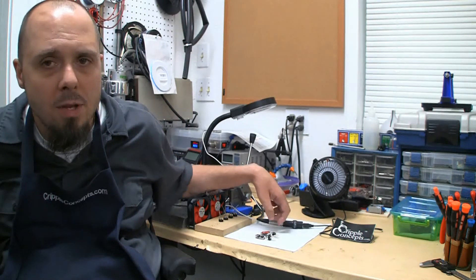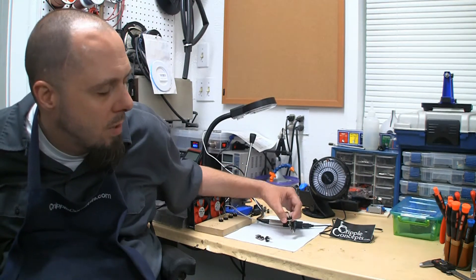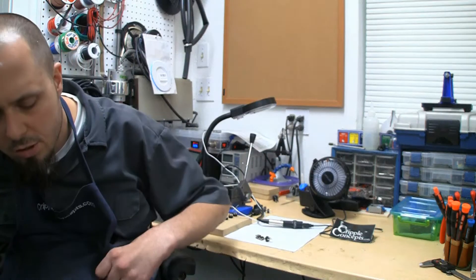I just took a picture. I'll be uploading this to the website to show off what the tweaks were. I'm going to bring this over to the camera.